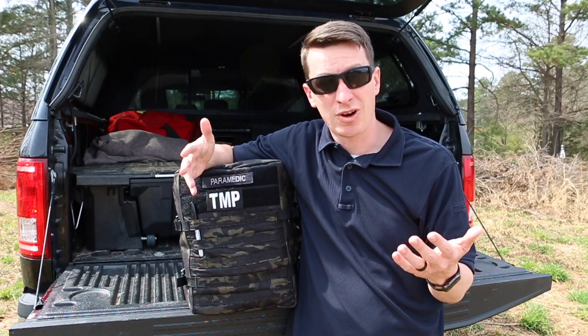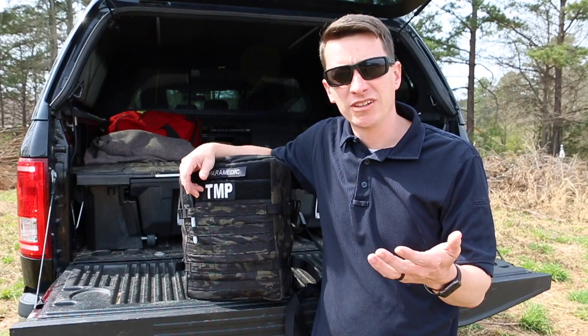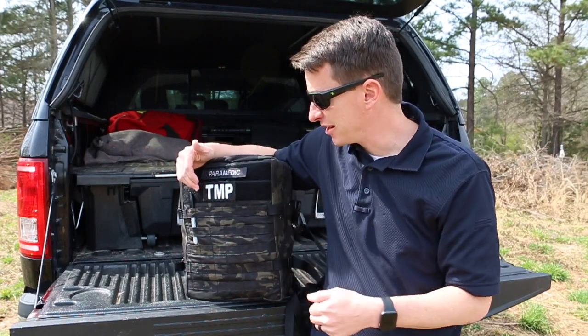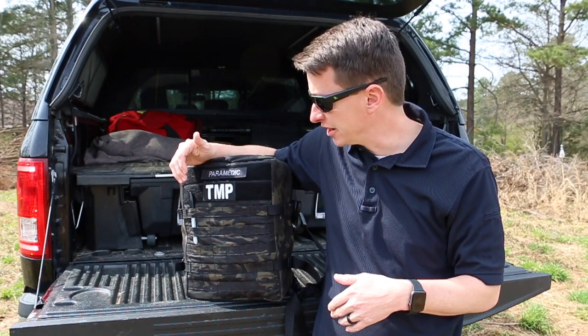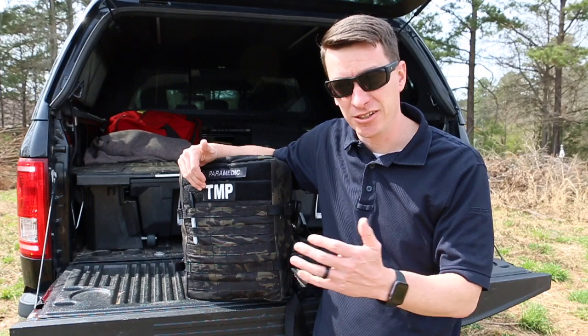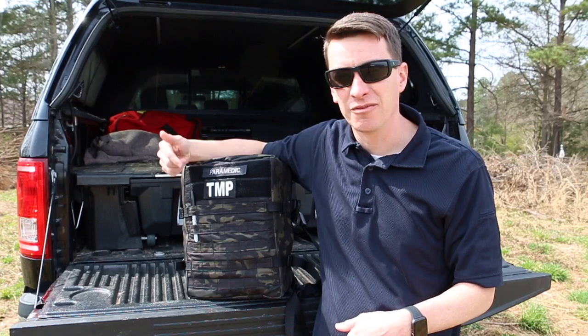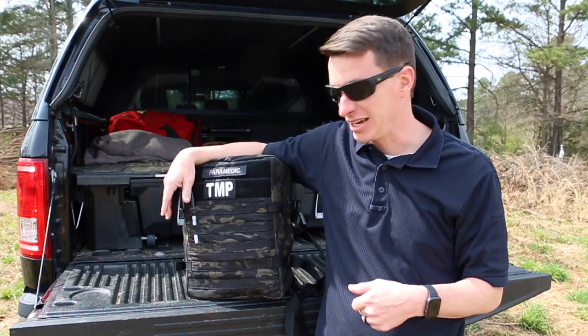This backpack right now has been used twice in the field and I've had no complaints with it so far. So before we look at the contents, let's take a quick look on the outside. Got my paramedic label tag. I took the TMP course, which allowed me to get my tactical paramedic certificate from SOAR Rescue last year — great course if you're in the field looking to practice. I always have a hard time finding my Sharpie, so I just went ahead and slid it on the outside right here, that way I know where it's at.